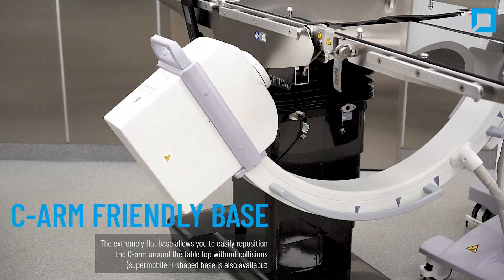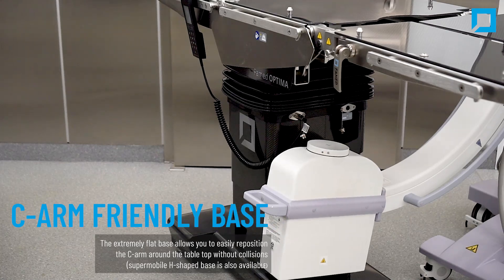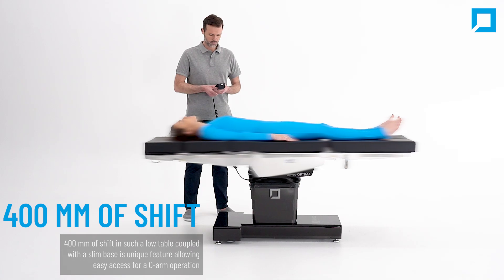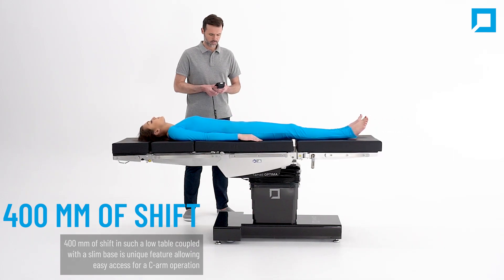The extremely flat base allows you to easily reposition the C-arm around the tabletop without collisions. With 400 millimeters of shift, this parameter in such a low table coupled with a slim base is a unique feature allowing easy access for C-arm operation.